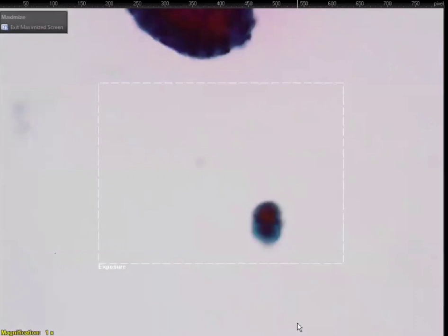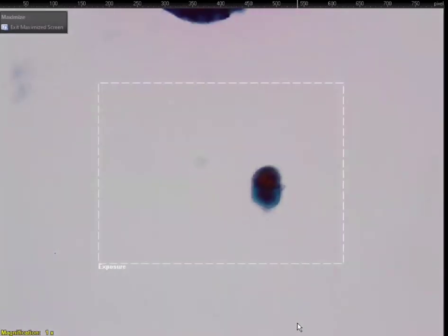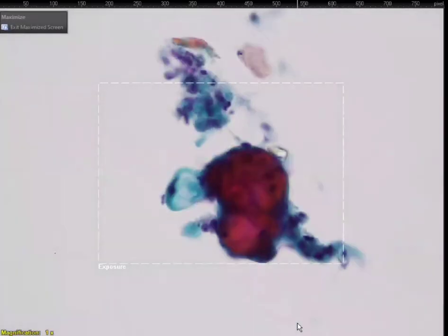Wow. Do you see anything in here? I don't know about the online people, but you guys should appreciate something in here. Look at the ring. Can you see the rings in there? Multiple rings.